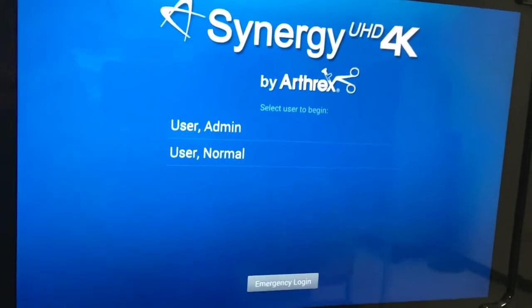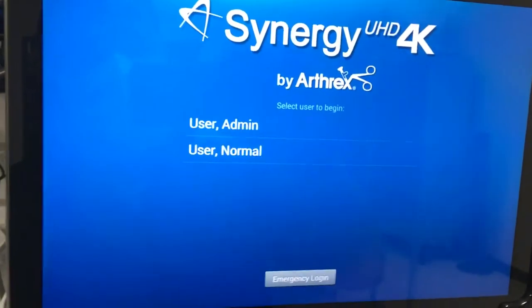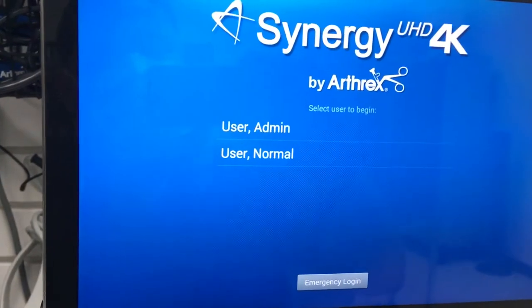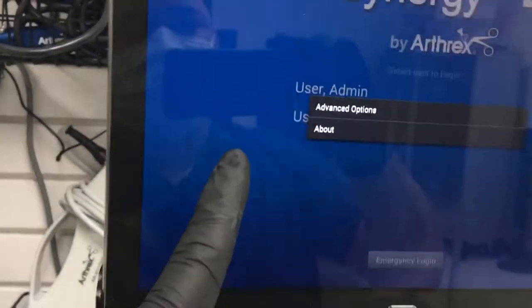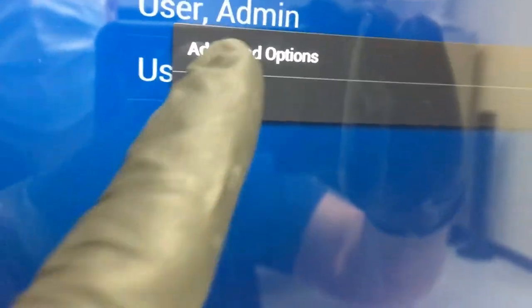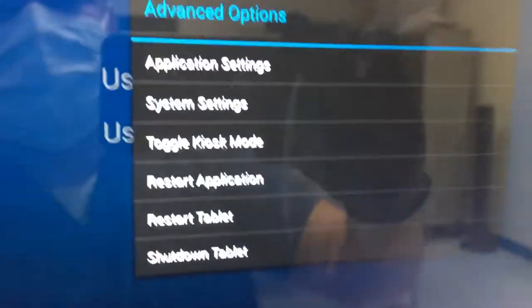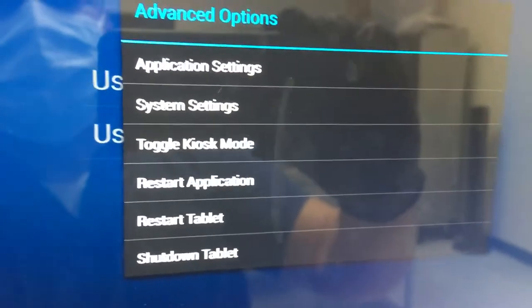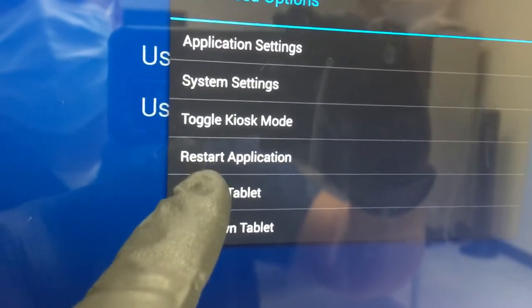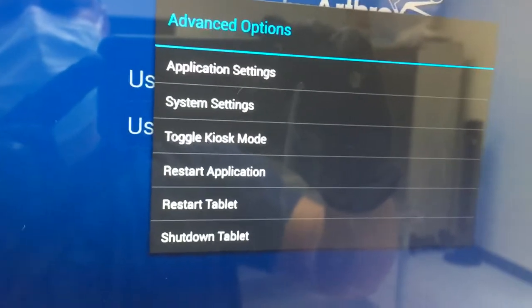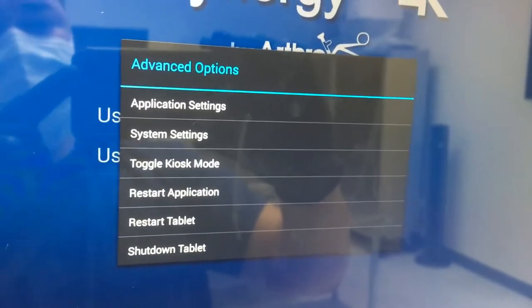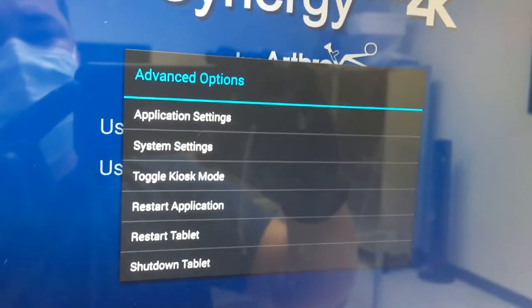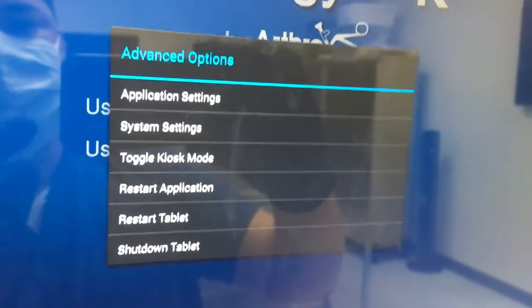if it says lost connection, what you can always do is double tap somewhere in the blue. You'll see it now says advanced options, so you'll tap that. You can hit restart application, and you can even do this mid-case and you're not going to lose any pictures already captured. It won't affect the on-screen image nor interrupt the case, so that's definitely something I highly recommend to try to get it back.